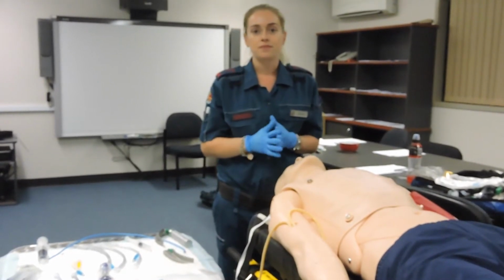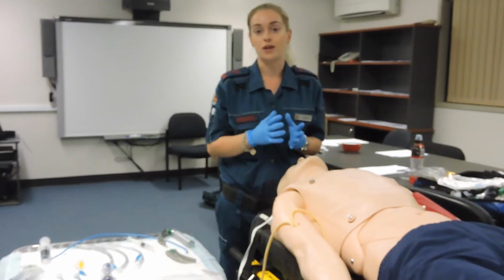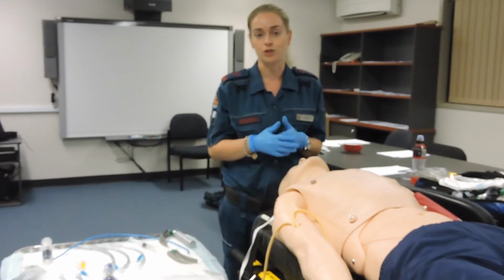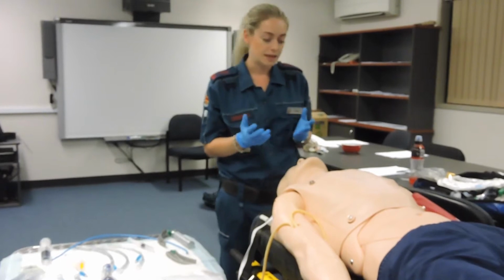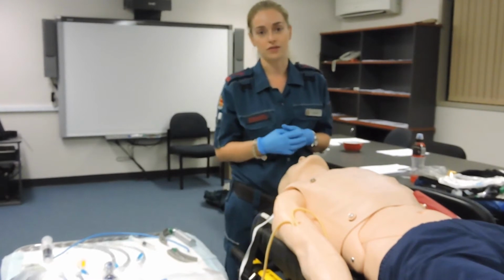This algorithm exists for the same reason we have a cardiac arrest algorithm: to ensure that if that situation arises, our human factors and stress levels can stay low and we know exactly what we want to do. In QAS, a standard CCP has the ability to cold intubate, which obviously doesn't carry as much risk as an RSI.